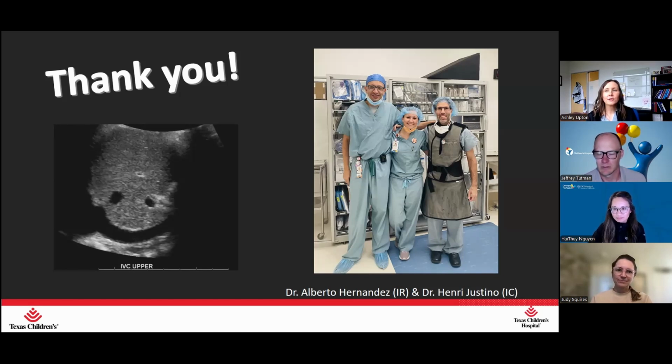So we just report out each measurement per segment. We do 3 values on segment 5 and 2 values on segment 8 in the liver, so a total of 5 in the liver. Each of those numbers are reported, and then we give the median IQR. And then we let the clinicians decide what to do with that information. We do include some of the literature, like the values that are reported that could go along with it being too high, but we give them the numbers and they can do with it what they would like and how they manage their patients.